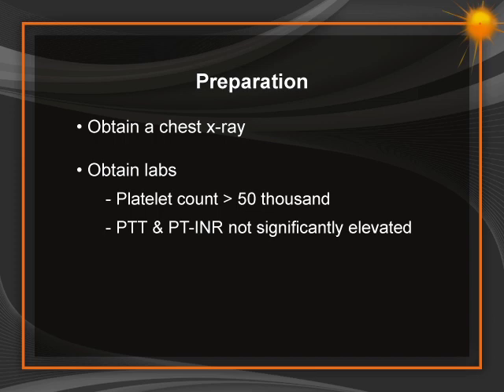Ideally, anticoagulants should be held before the procedure. For example, intravenous heparin for 6 hours, low molecular weight heparin for 24 hours. However, anticoagulation is a relative contraindication, and the risks should be weighed against alternatives such as reversal of anticoagulation or delaying thoracentesis.